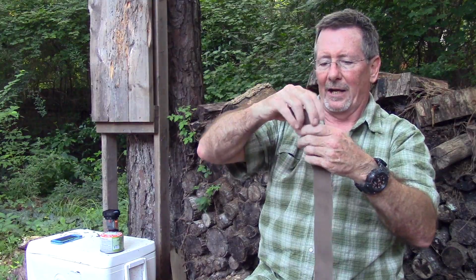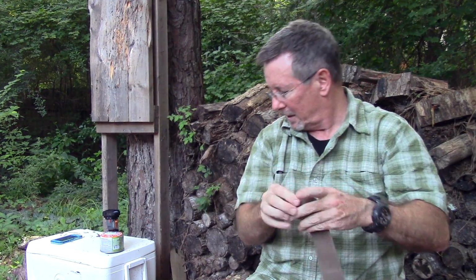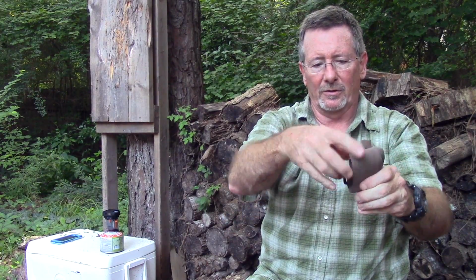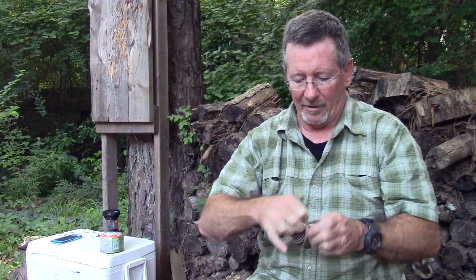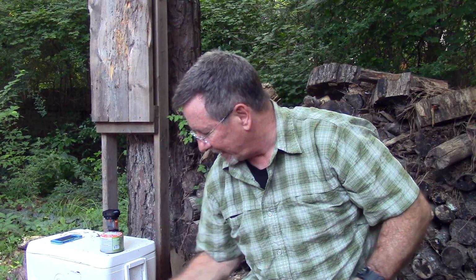The other thing I really like about this is, this is kind of the way I carry this one. It's just a roll up like this with a little rubber band around it. I fold this under so there's no metal poking out, and just put a rubber band around it. I can tell you this particular tourniquet has been through TSA in my pocket with no problems. I forgot to take it out one time, and it went right through the scanner. So there's that. That's the TK4.